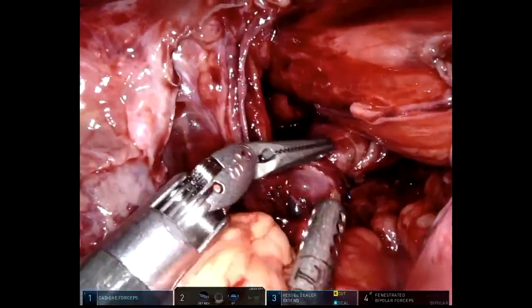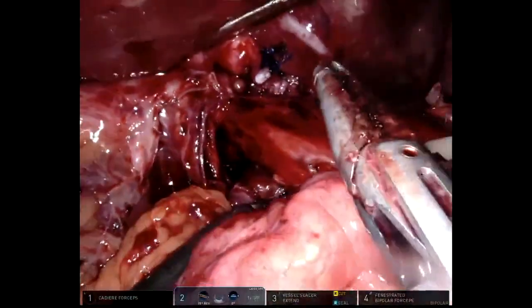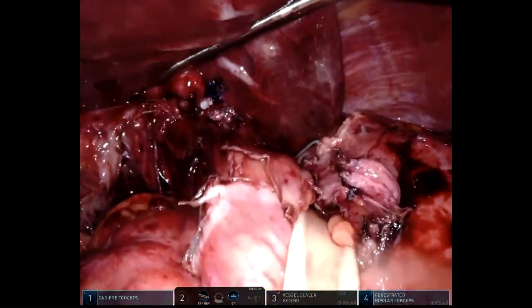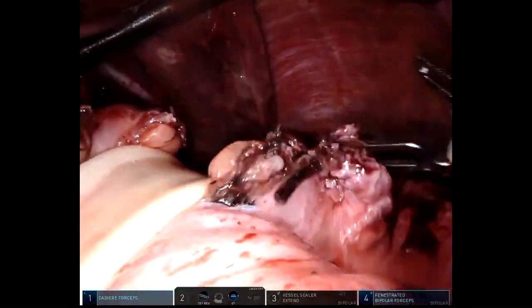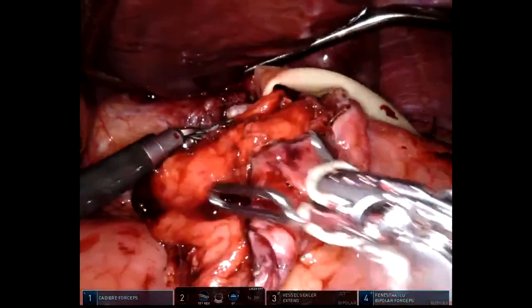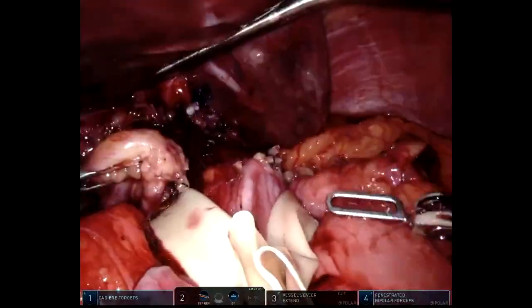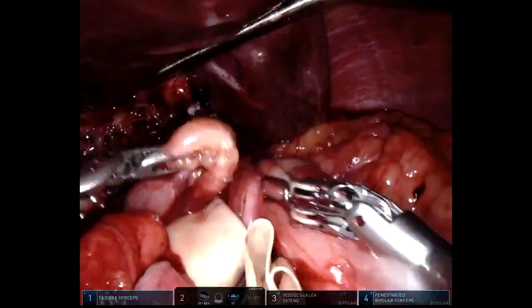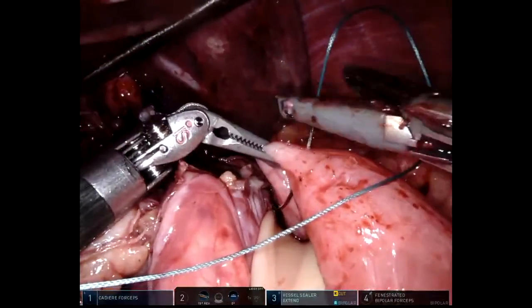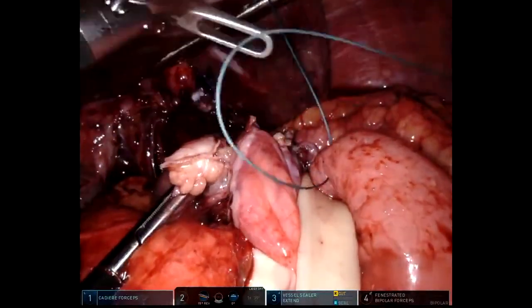Additional sutures are going to be placed. We now proceed in retrieving the fundus in order to perform a Nissen fundoplication. The fundus is brought around, making sure that it easily comes through. That is the shoe-shine maneuver, confirming that the portions of the fundus and the rest of the stomach can be re-approximated together.